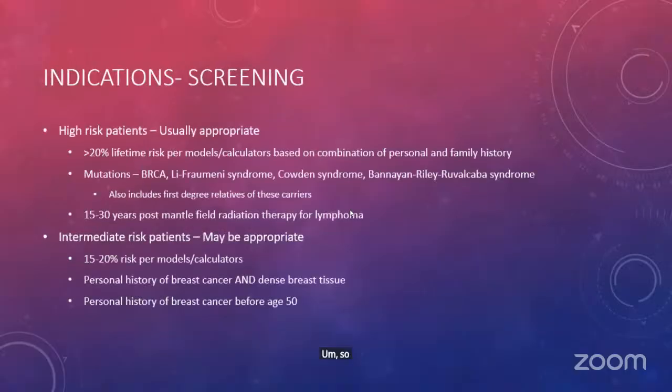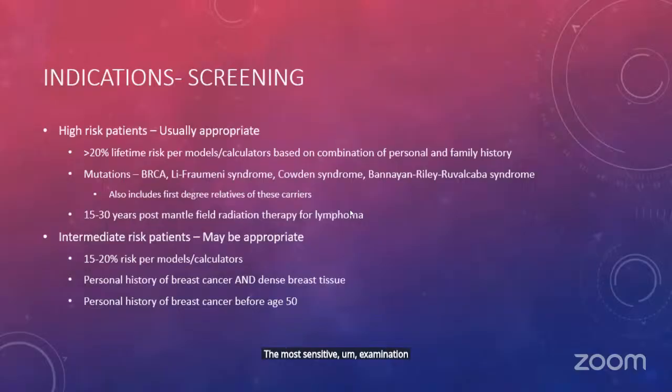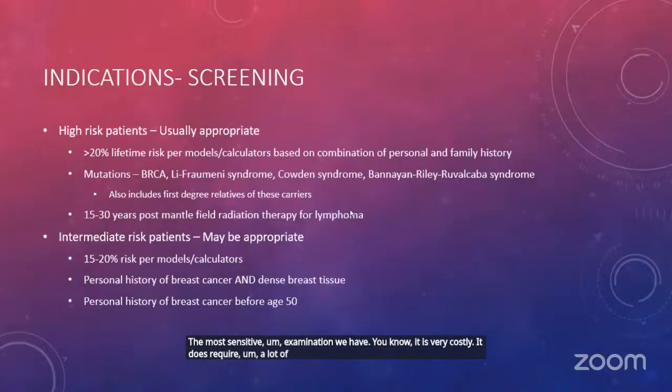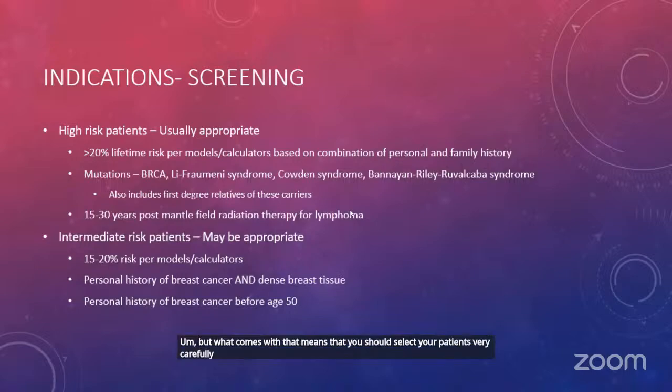So, getting started with the indications. The main thing about breast MRI is that it is the most sensitive examination we have. It is very costly, it requires a lot of time in the scanner, and it's very uncomfortable for the patient, but it is worth it because it is the most sensitive exam for detecting breast cancer. But that means you should select your patients very carefully, because there are a lot of benign entities that show up on MRI as well.